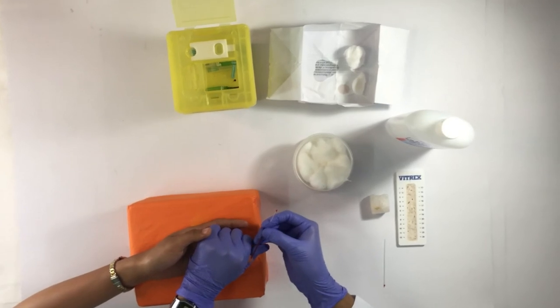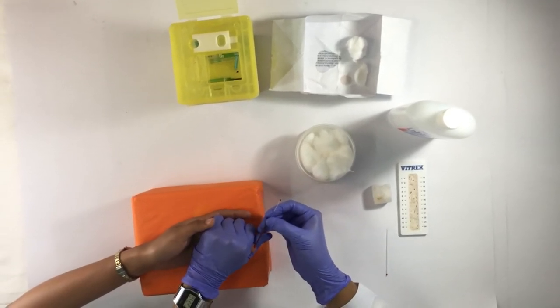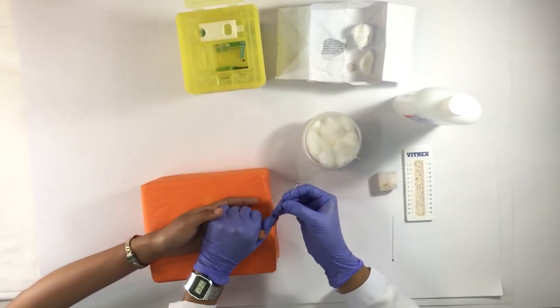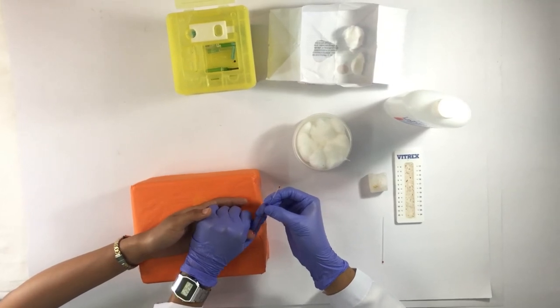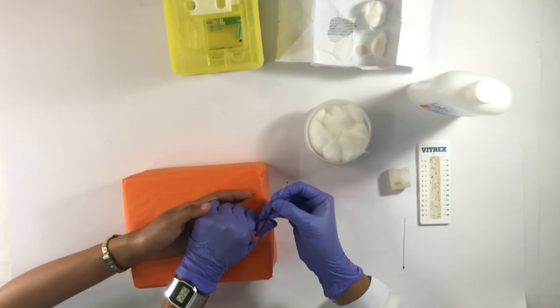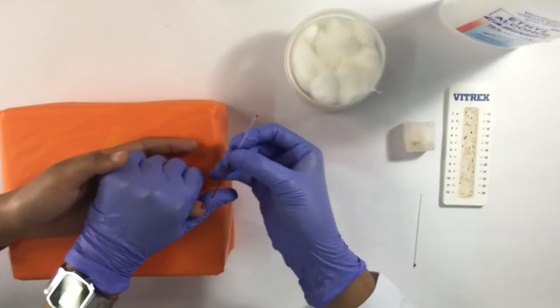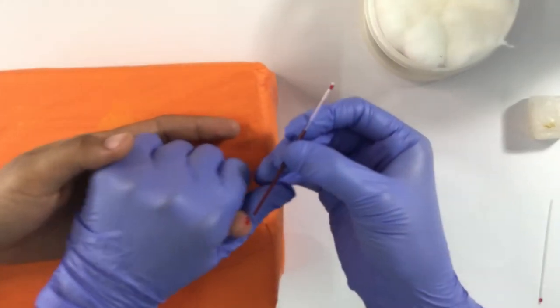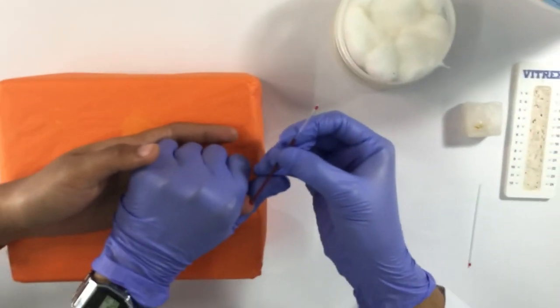Fill the capillary tube with blood sample by pressing and releasing the finger of the patient. Fill two-thirds or three-fourths of the capillary tube and make sure that there are no bubbles or spaces seen after collection.